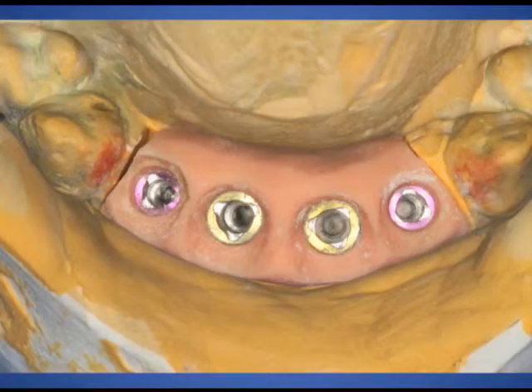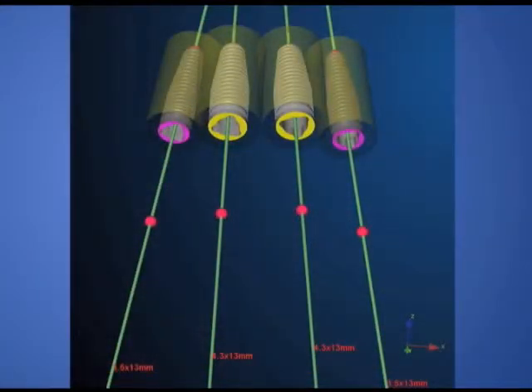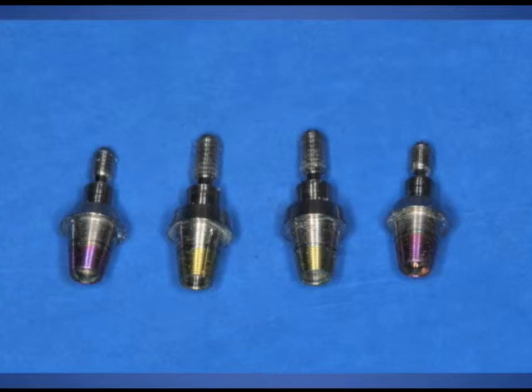After the CAT scan was completed and the Nobel Guide CT scanning software was used, the dental laboratory actually fabricated a model. Again, this is prior to me ever touching the patient, to determine the correct position or ideal position of the dental implants. Again, 3.5 millimeter replace implants in the lateral incisor areas, and 4.3 replace select implants in the 2 central incisor areas. This is all done preoperatively by our dental laboratory.